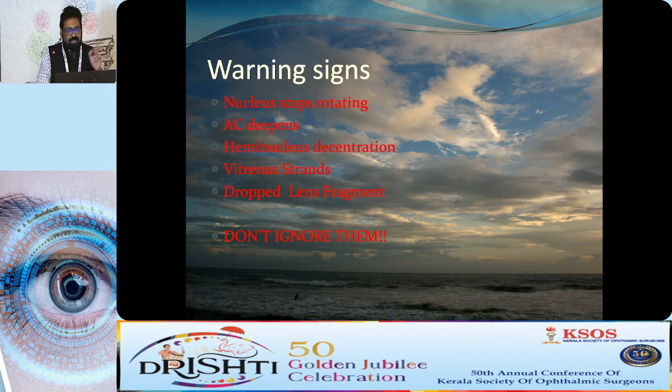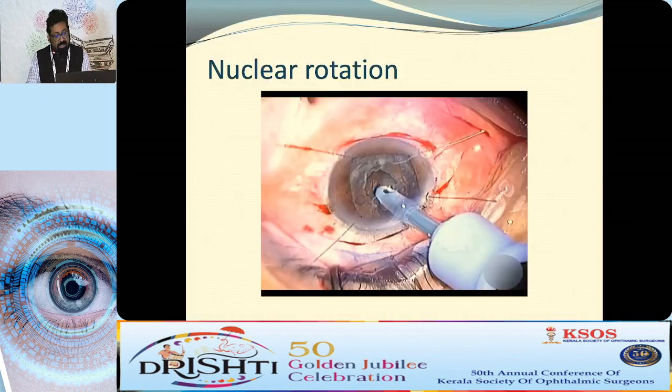Stop, think, and then go ahead. Suddenly a deepening of the AC, or if there is a decentration of a heminucleus much beyond what you would expect, vitreous strand, and obviously dropped lens fragment, then if you continue, it is disastrous. So don't ignore these signs.